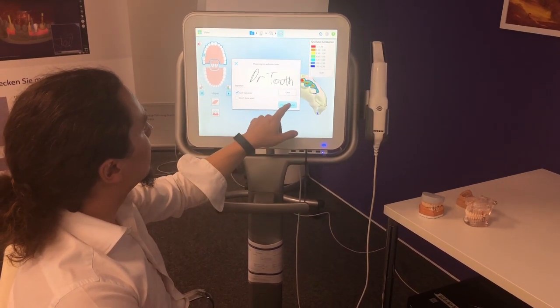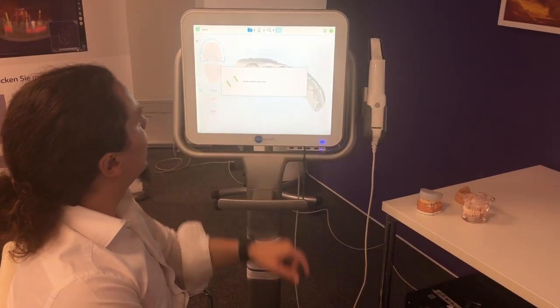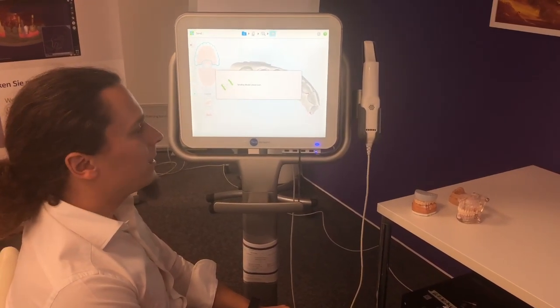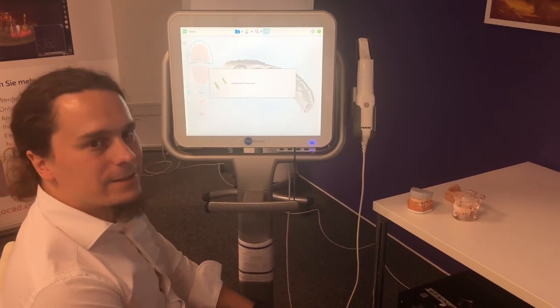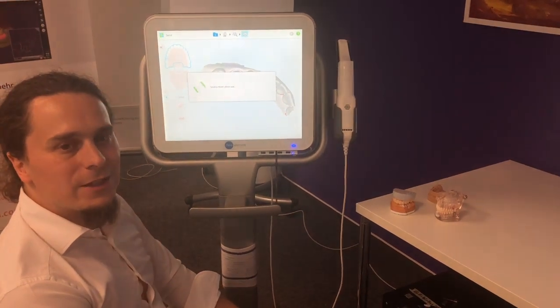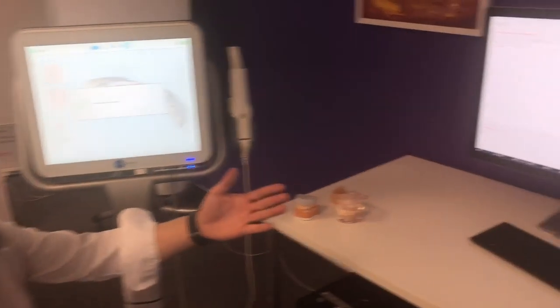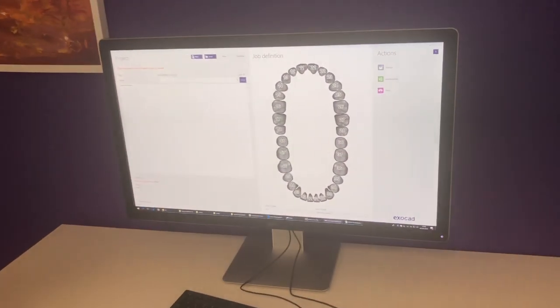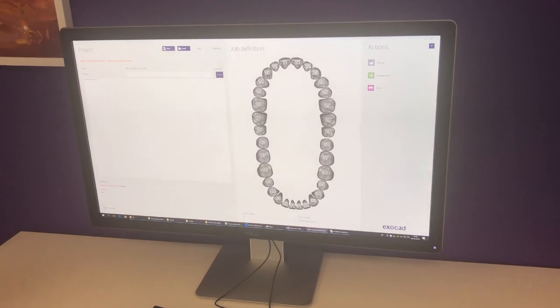After a short while the files will all be transferred to the other PC and the notification will be visible.